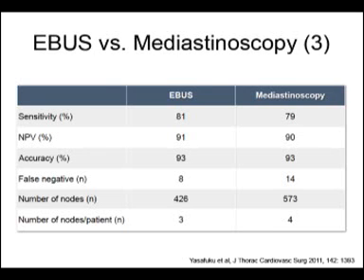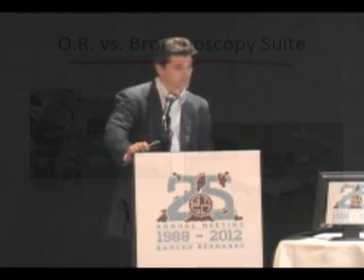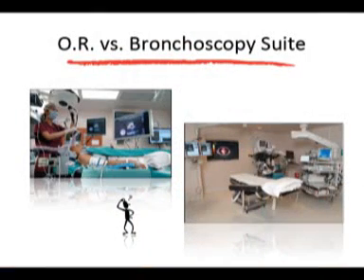More nodal tissue was obtained by mediastinoscopy, and there were a higher number of nodes per patient biopsied by mediastinoscopy, but this did not translate into improved staging accuracy. Next, please. So in the last couple of minutes, I just want to touch on the decision as to whether or not to perform this in the operating room or the bronchoscopy suite. Traditionally, when we started doing this at Anderson, we certainly did this most of the time in the operating room.